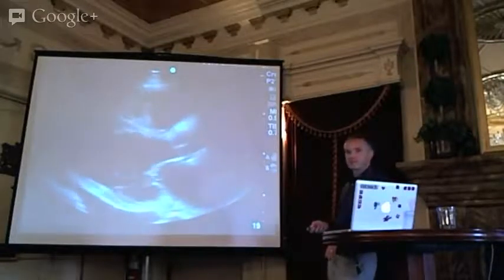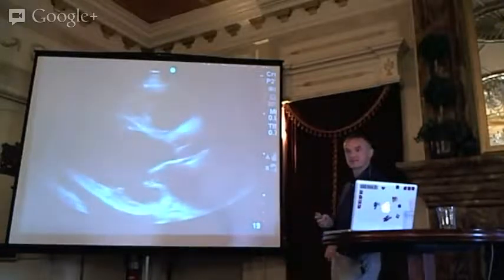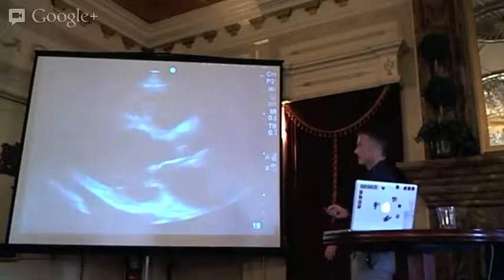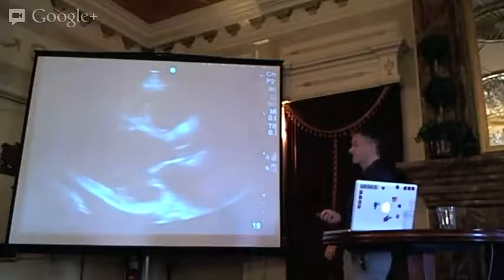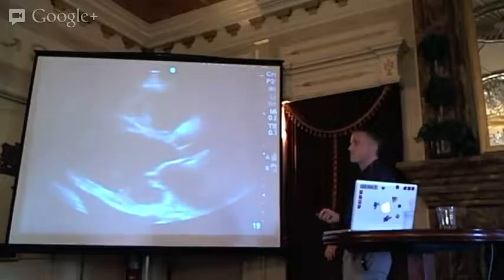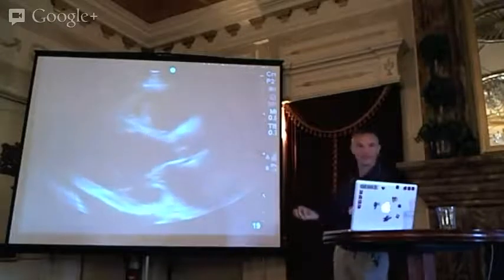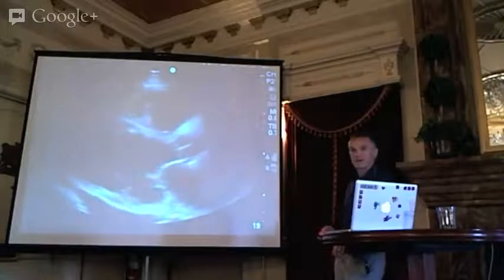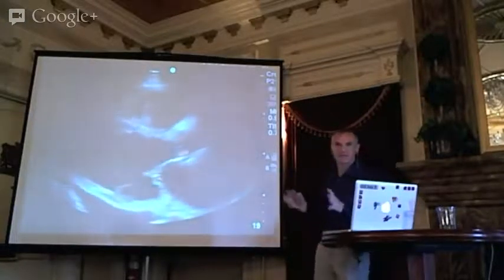What about pump function? Global assessment of LV systolic function. Poor. Yeah, that'll do. Right, it's got a poor pump, isn't it? The ventricle isn't really changing much between systole and diastole. The anterior mitral valve leaflet is hardly reaching the septum. Markedly impaired systolic function by gross visual assessment. That's what I would write. And he has a pericardial effusion, with no obvious features of tamponade physiology on basic 2D ultrasound.